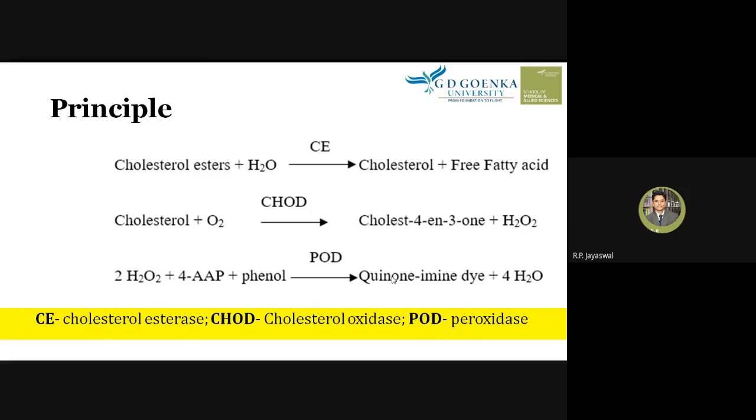More color, more absorbance. More absorbance means more concentration of cholesterol. That is what you have to understand. I hope you have understood the principle of this cholesterol test.